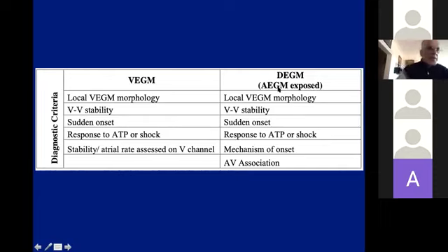How did we do the study? We took 100 device electrograms that were complex, 50 SVT and 50 VT electrograms, and we covered the atrial channel initially, and we gave it to EP specialists, seasoned attendings. We gave it to fellows, and we gave it to EP nurses. Then we had them interpret and say what it was and what criteria they used. After that, we uncovered the atrial channel and gave them the same electrograms in a different order and had them reinterpret.